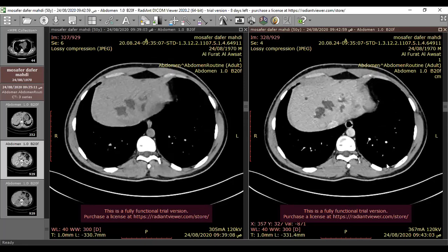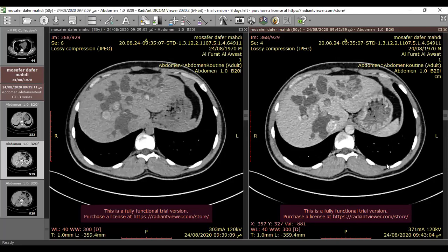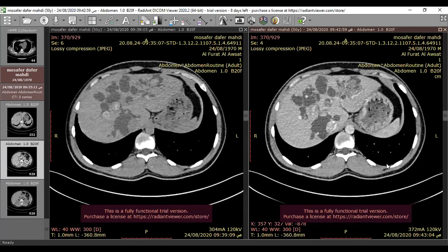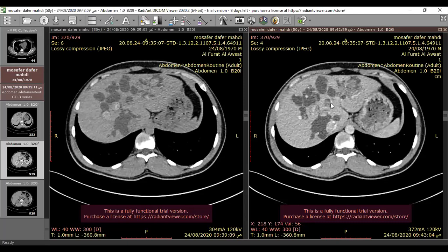What does this mean? It means there are intrahepatic stones — intrahepatic hepatolithiasis. The overall picture most likely corresponds to Caroli disease, complicated by hepatolithiasis. The intrahepatic biliary dilatation without direct obstruction is characteristic.